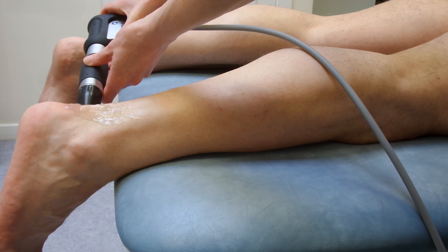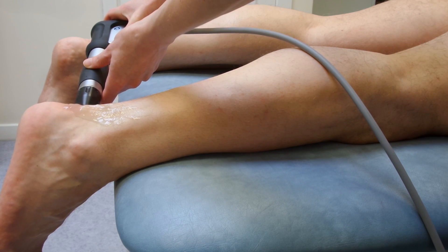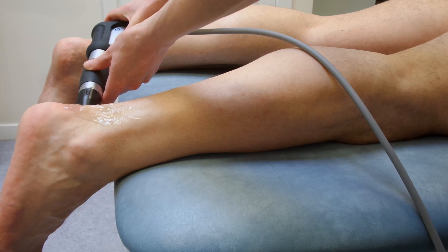As you can see, we're coming across from the medial side of the leg through the spur to the outer side of the leg. We'll continue to do spots around the calcaneal spur. This is a posterior spur, not an inferior spur that some people would refer to as plantar fasciitis or a plantar fascia spur.